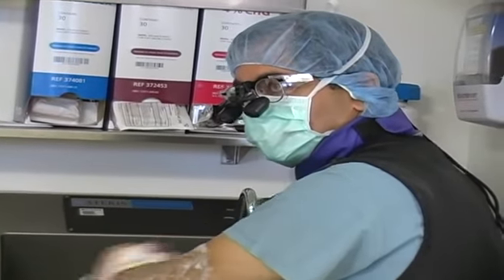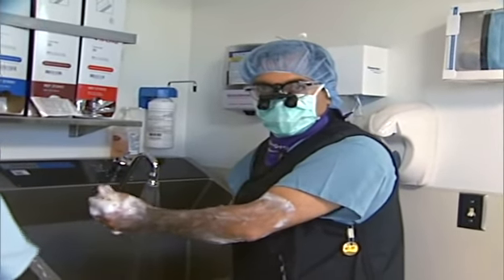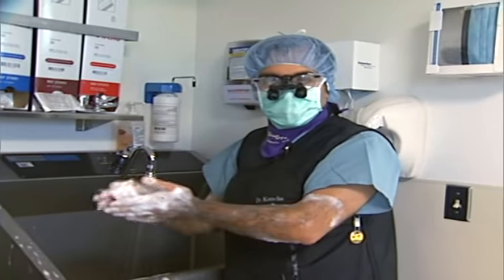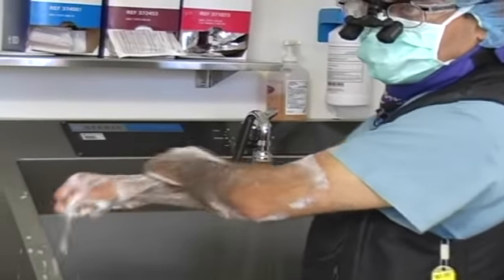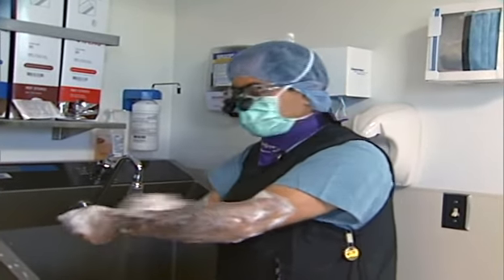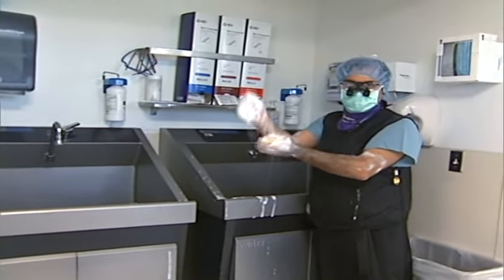This is pretty unique. The PEEK material that we're going to be using is specifically for patients with osteoporosis. The previous material that I was using was titanium. It was all titanium design, which actually puts a lot of stress on the bones. So the people who have osteoporosis have a higher risk for fractures. With this new device that we have, which is going to be the first one in Michigan, it's made out of PEEK, which is a substance which looks like plastic but extremely strong, and it's not as hard on the bone as metal would be. And this lady actually has got osteoporosis, so she's got a soft bone. So I've actually been waiting to implant this in her for a while, and she's been getting worse over the past few weeks and past few months, and this device has just come out in a timely fashion, so it's going to work out beautifully for her.